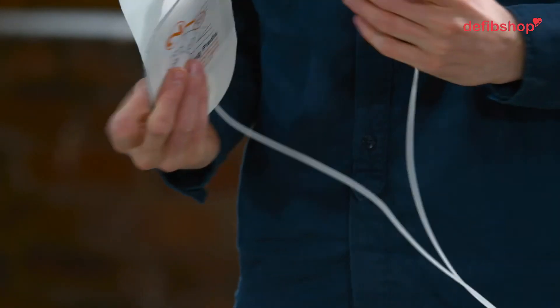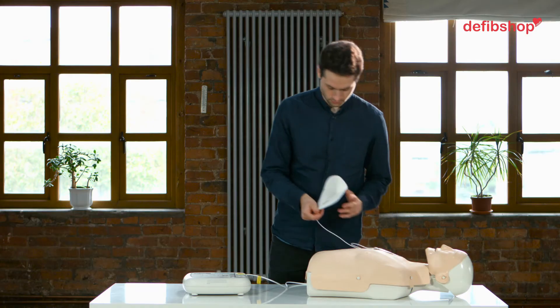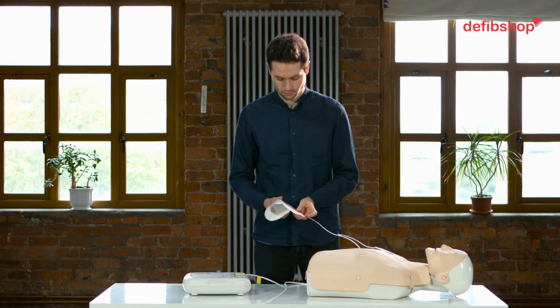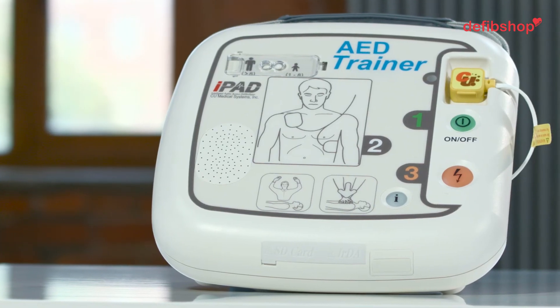Peel off the pads labelled 1 and stick to the bare skin of the patient. Peel off the pads labelled 2 and stick to the bare skin of the patient.